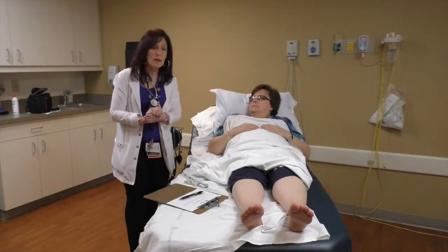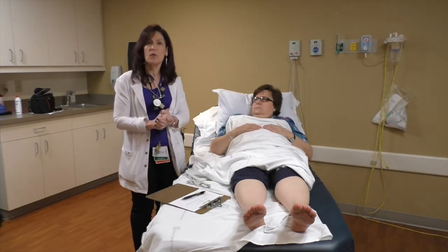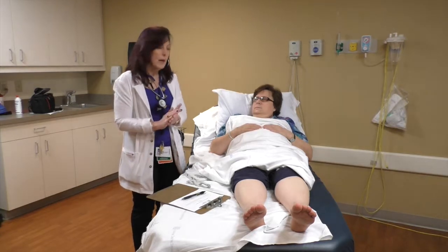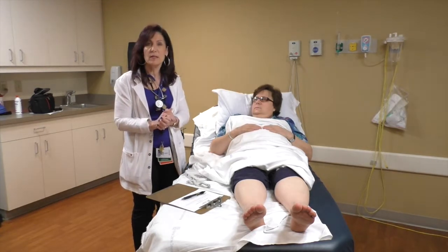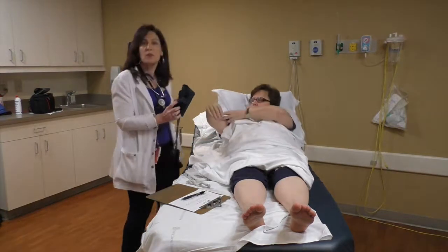So this is an ABI test and I'm just going to walk you through it. First, you would have the patient remove their socks and shoes and lie comfortably on the bed. You basically want to stabilize their blood pressure, so give them a few minutes of resting.